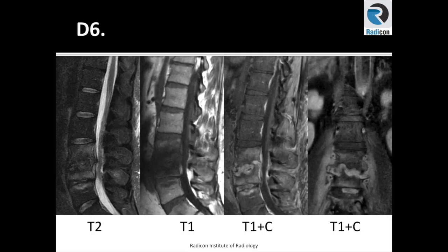Let's look at this case. On the left side, fat-saturated T2-weighted images demonstrate abnormal signal of L3 and L4 vertebral bodies along with obliteration of the disc space. Significant edema in both vertebral bodies suggests marked edematous change, which is further confirmed on T1 where the marrow signal of both vertebral bodies has been replaced. You can also see epidural space abnormality.